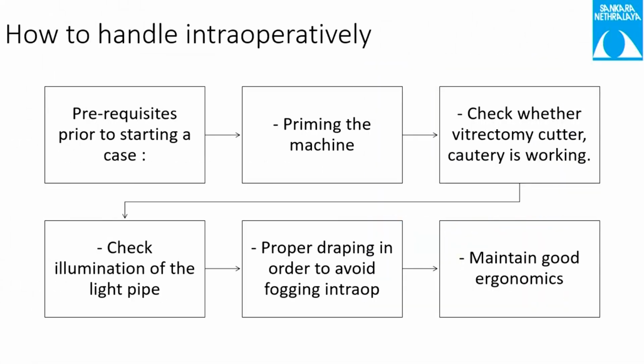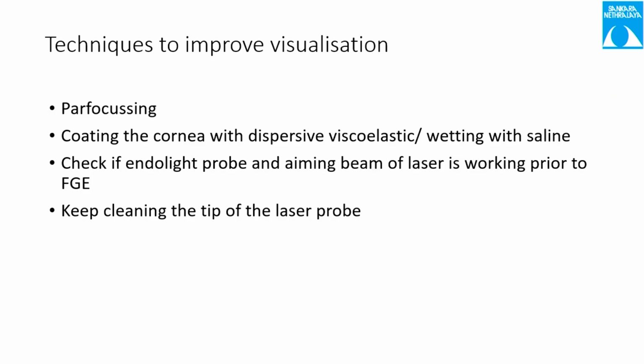Before starting the case, definitely make sure that the machine is primed properly, that the cutter is working properly, and definitely check the illumination of the light pipe. It's very important, because once we start doing the laser, if the illumination goes, then it's going to be a problem. And maintain good ergonomics in most of the cases. So as I already told, good focusing is very, very important to maintain a proper visualization of the laser and of course the surgery as well.